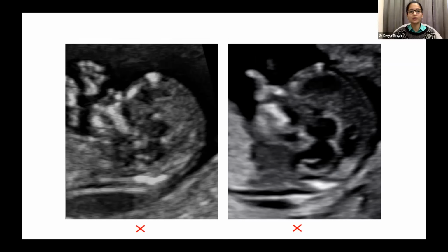These are just to show you some poorly taken NT images. You can see much of the landmarks here. You can appreciate some kind of an NT, though it appears fuzzy, but this is firstly a flexed image and a parasagittal image. It's just to show you what a parasagittal image looks like. Here, the palate no longer appears rectangular, but you can appreciate this white line, which is the frontal process of the maxilla, which would be seen if you go slightly parasagittal.